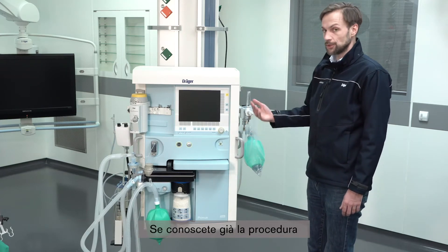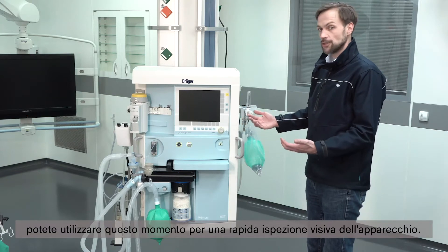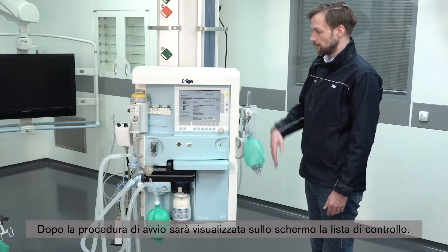If you are familiar with the procedure, you of course can use this time for the visual inspection of the device. After the booting procedure, the checklist will appear on the screen.